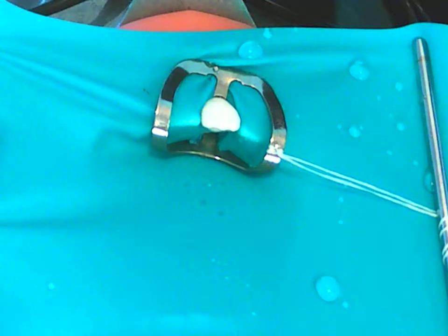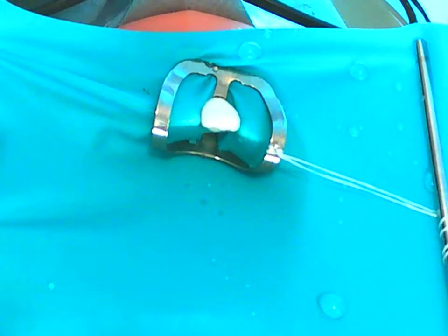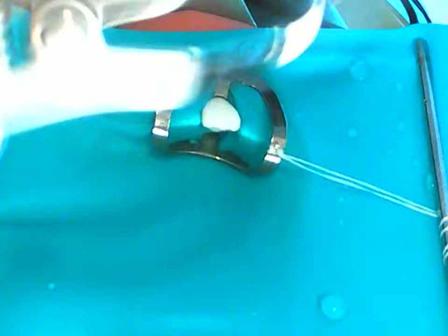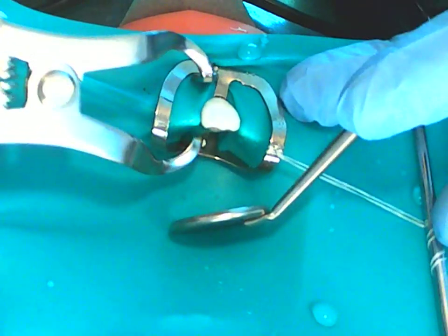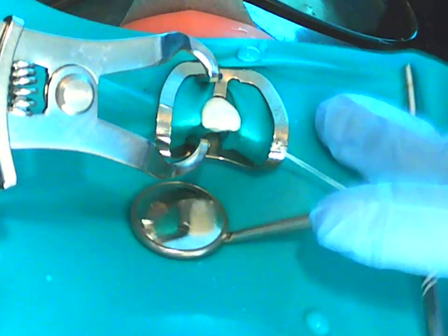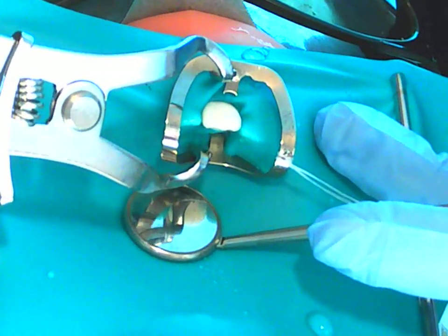Good. And then you may go into the removal. I will be using my mirror for indirect vision. Okay. So the forceps, I'll line it up on the facial and then use my mirror for indirect vision on the lingual. There we go. Once you're in there, just squeeze the forceps, opening up the clamp. Let go of the clamp. Forceps, let it hang on your frame.